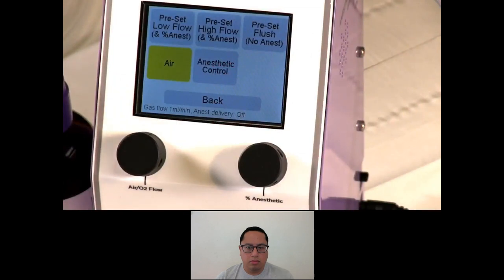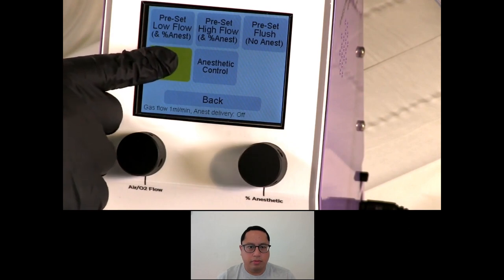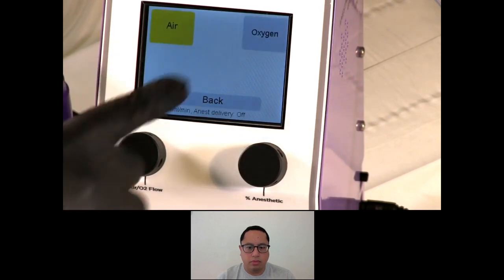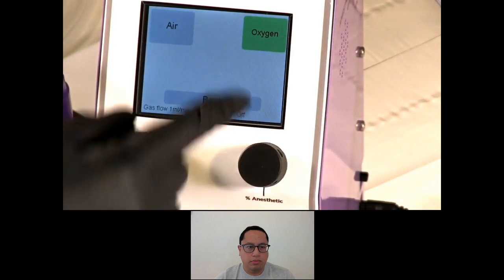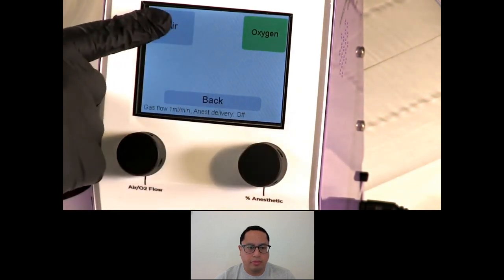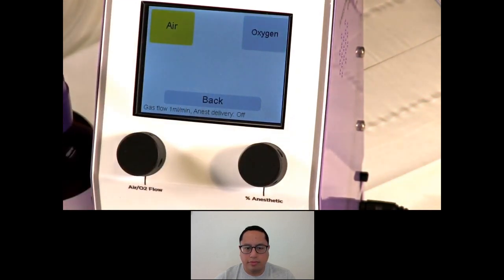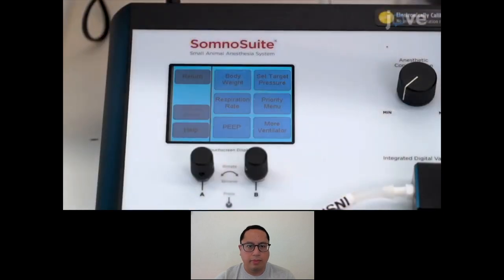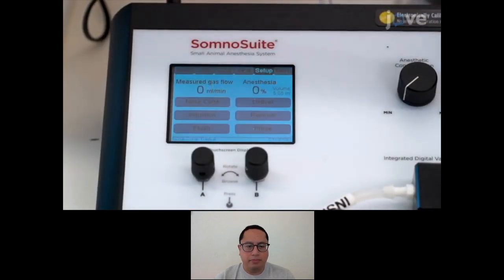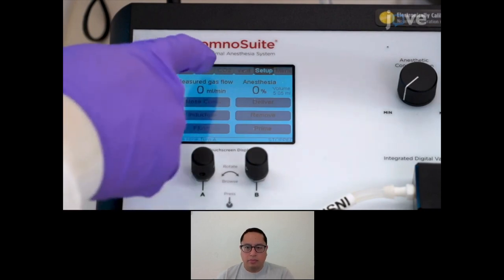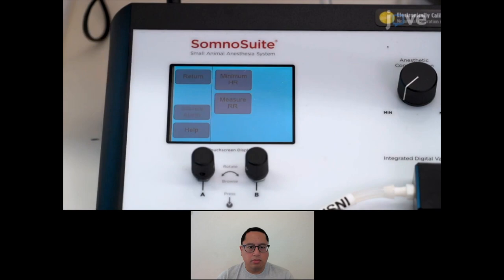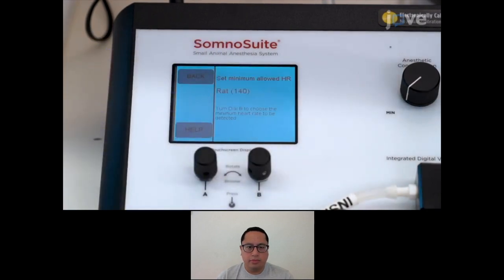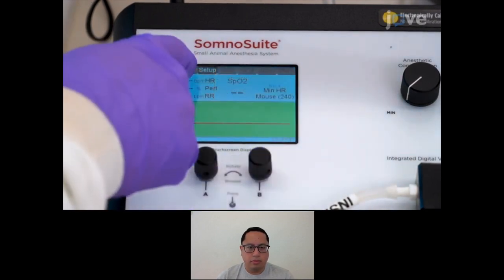Both Somno low-flow electronic vaporizers can be connected to a compressed gas source, but neither require the use of compressed gas to deliver inhalant anesthetics. Their included internal pump draws in ambient air, giving users the option to anesthetize animals in settings where gas tanks are not available or not feasible to use. The SomnoSuite is designed as an all-in-one modular surgical solution and can be programmed with integrated warming, pulse oximeter, ventilator, and capnography capabilities. This eliminates the need for multiple controllers and separate computers in the surgical suite.